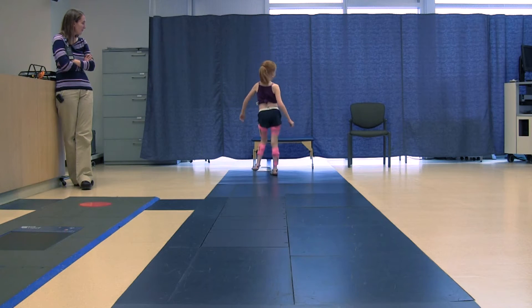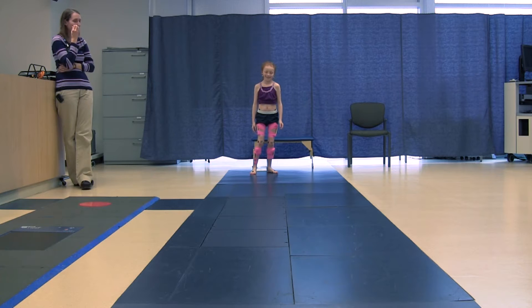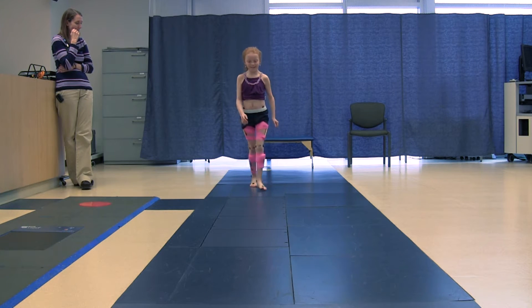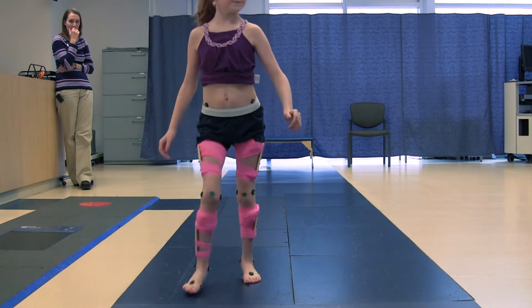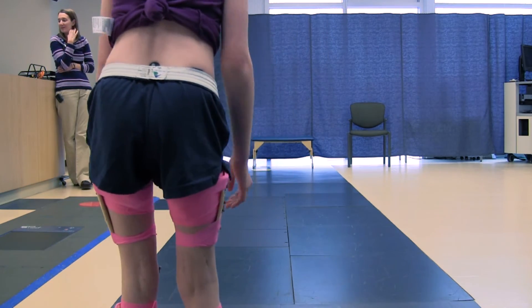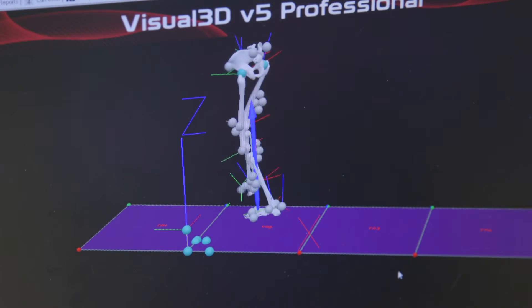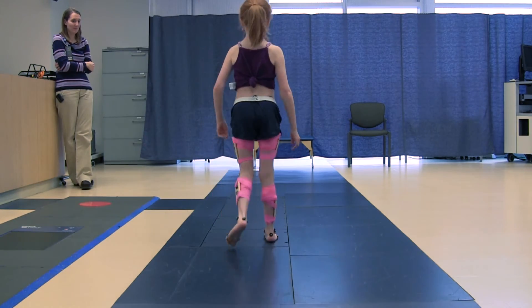I will walk over and stand on a colored dot so that my testing can begin. I will wait for the lab assistant to tell me when to go and start walking. I will walk down the blue line on top of the squares in the floor to another colored dot. Once I am there, I will stop, turn around, and wait for the lab assistant to tell me when to go again. When I am walking, the lab assistant will record a video of me. I will continue to walk back and forth until the lab assistant tells me I am finished.